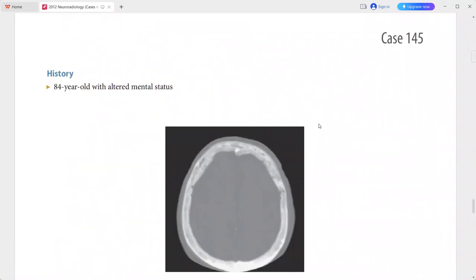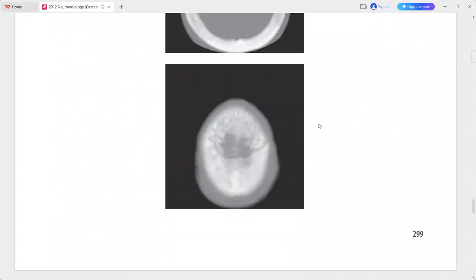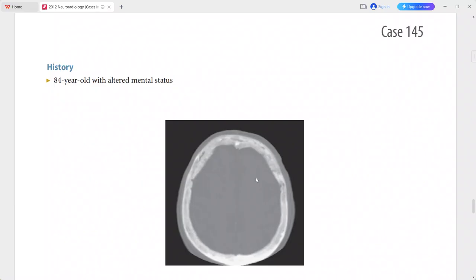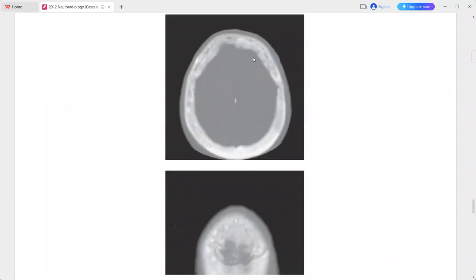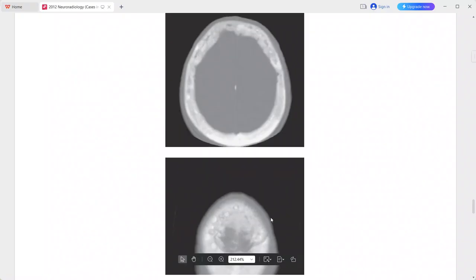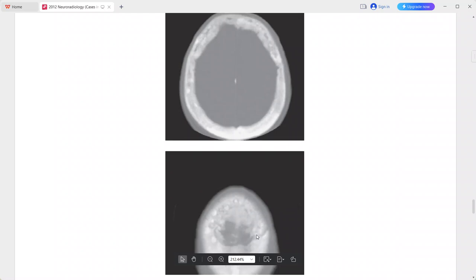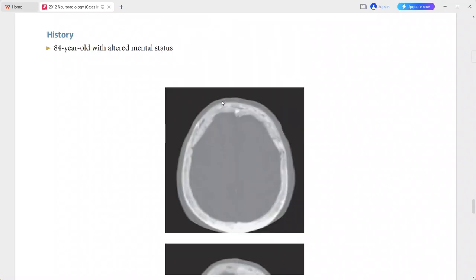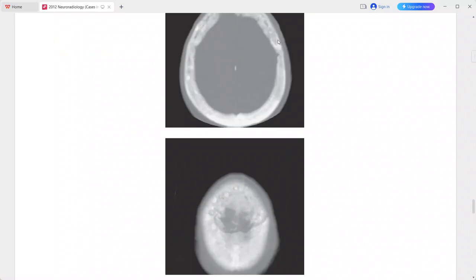Next is a case of an 84-year-old man presenting with altered mental status. On the CT scan bone window, there is a large zone of abnormal mixed increased density in the frontal bone with a sharp geographic zone of transition. This mixed osteolytic and osteoblastic process is producing a cotton wool appearance.